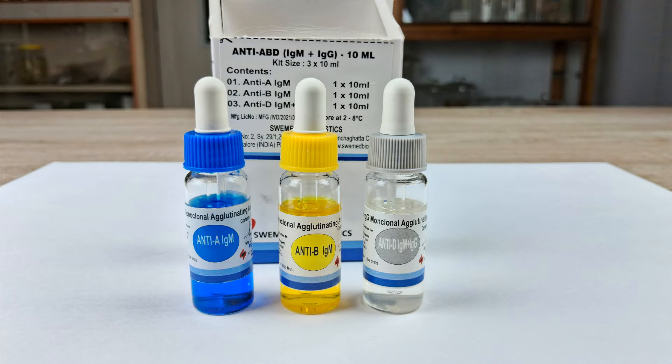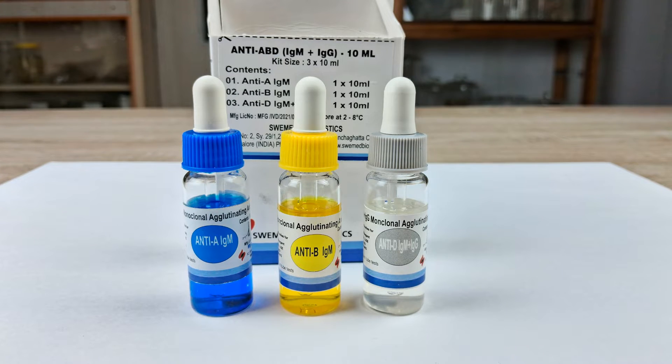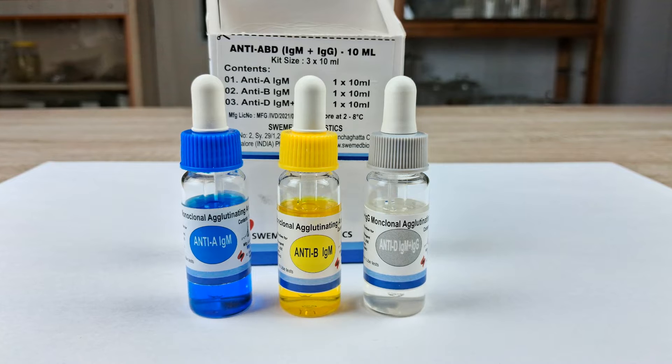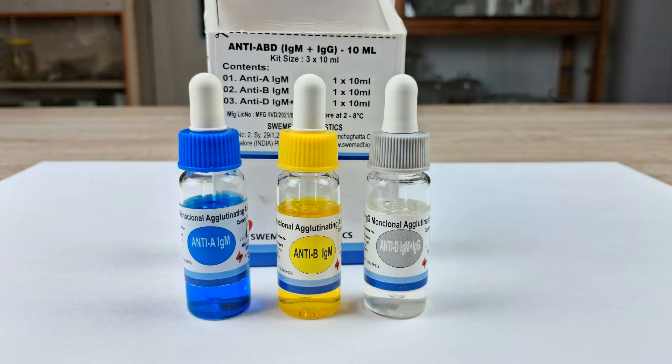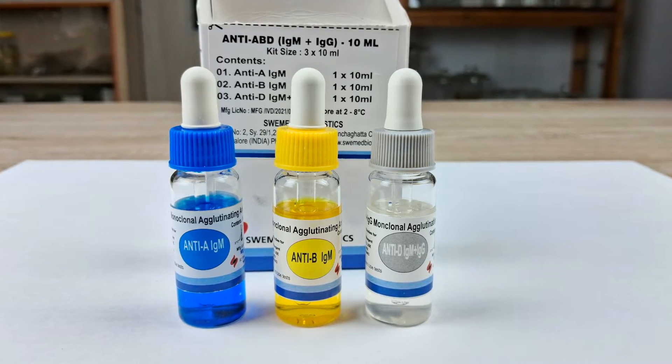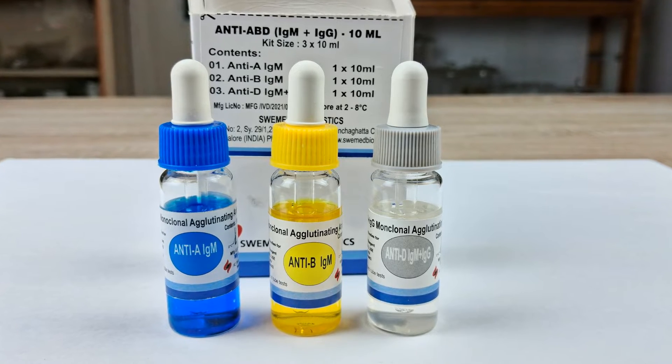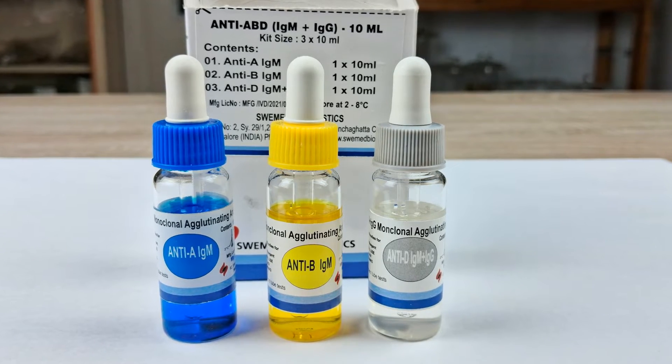In a diagnostic lab, the ABO and RH blood grouping is done using a diagnostic kit that consists of monoclonal antibodies for A, B and RH antigens. Monoclonal antibodies against antigen A, also called antisera A, comes as a blue-colored liquid reagent in a small bottle with a dropper.